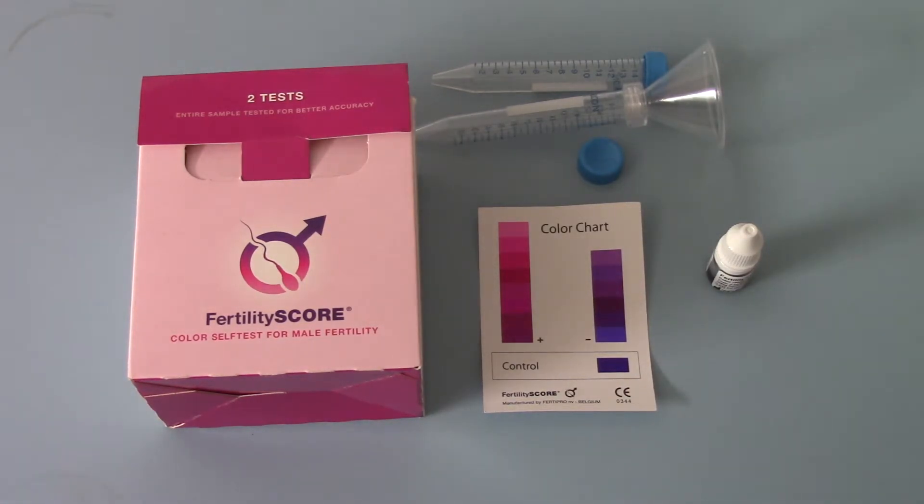FertilityScore is one of the first and only products onto the home testing market which allows you to test both the actual numbers and the motility of sperm in the convenience of your own home. The advantage of testing motility is that sperm, if they aren't motile, may be there but they're of no actual advantage in terms of conception if the motility is not good. So by screening both the number and the motility you get a very good indication of the overall fertility of the sample being tested.